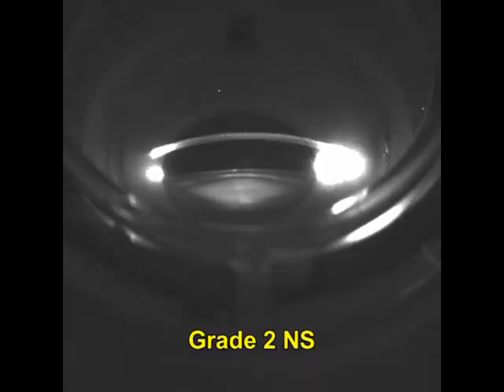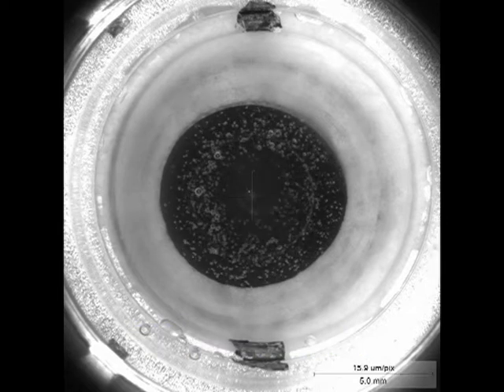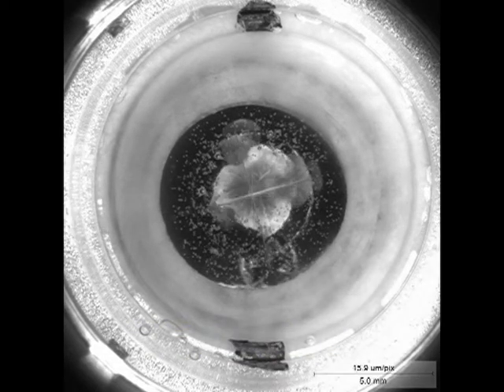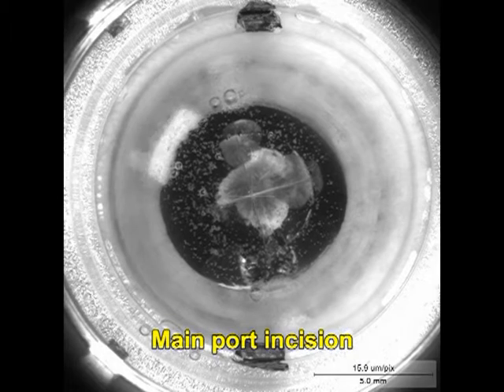Here is the imaging which shows the amount of nucleus sclerosis. A pre-surgery H test is done, followed by a 5 millimeter capsulotomy and a two-plane chop. The arcuate keratotomy incisions are then made at 85% depth and 30 degrees arc length.